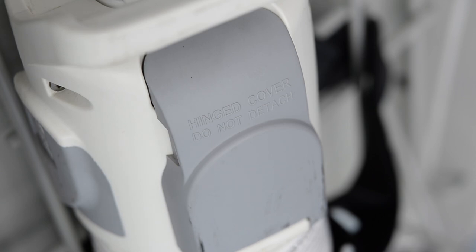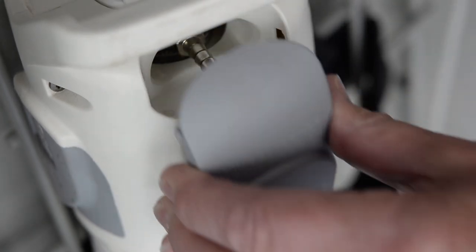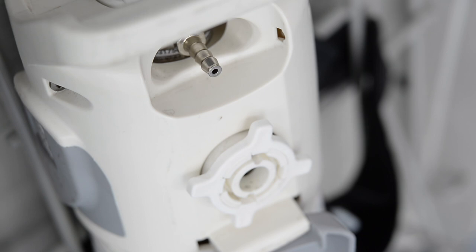Remove the valve outlet cover. The hinged grey cover is pulled down. Do not remove the grey cover as you can refit it after use.